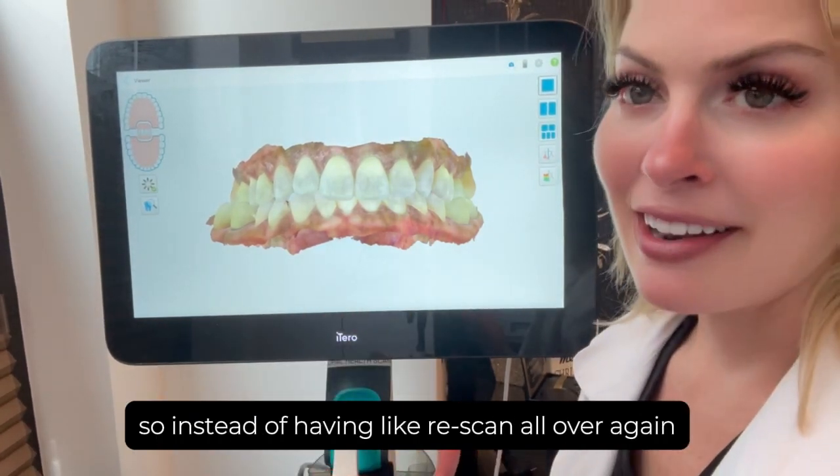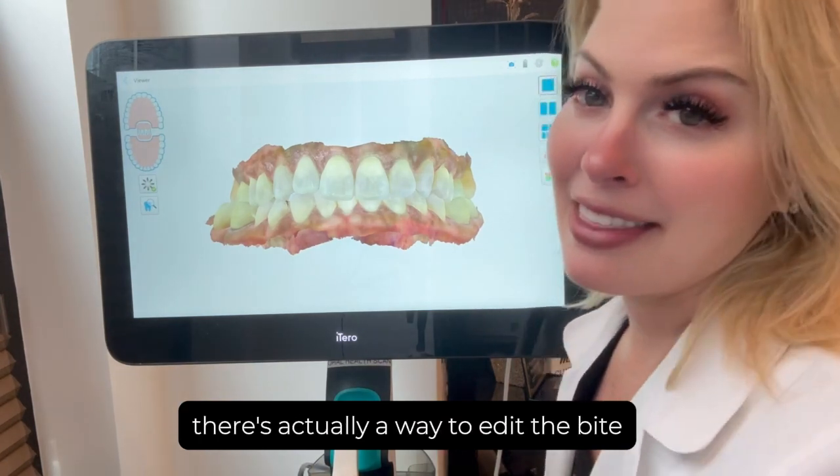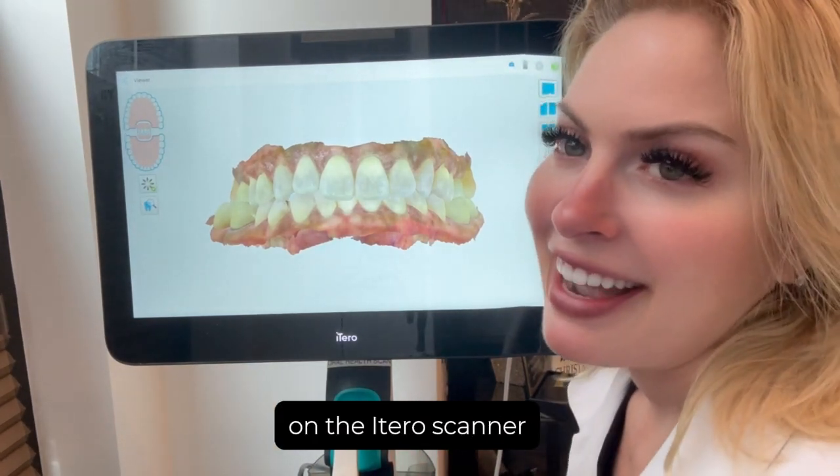So instead of having to rescan all over again, there's actually a way to edit the bite. This video is about editing the bite on the iTero scanner.